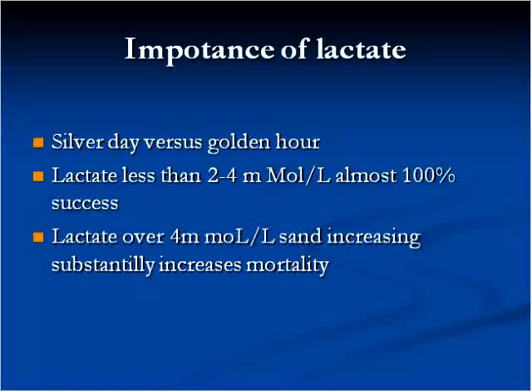One person asked about blood gases daily, in parentheses routine, for all ventilated patients in the ICU. I guess what they're asking is, we used to get that morning blood gas, it happens to everyone, doctors making rounds and stuff like that. Is that an outdated practice?